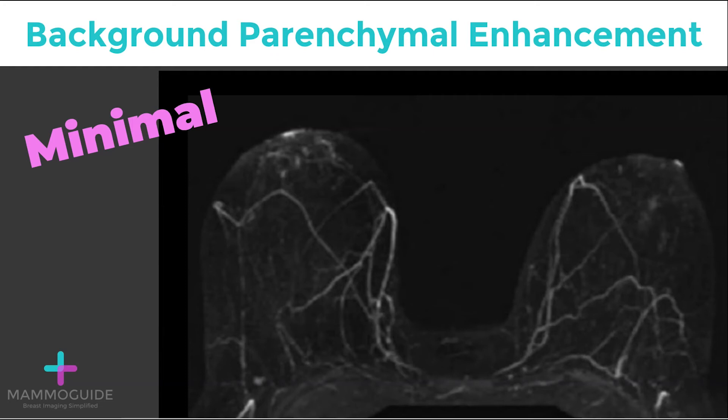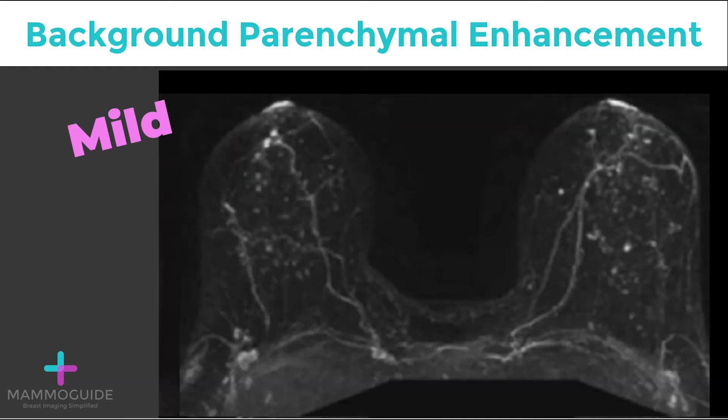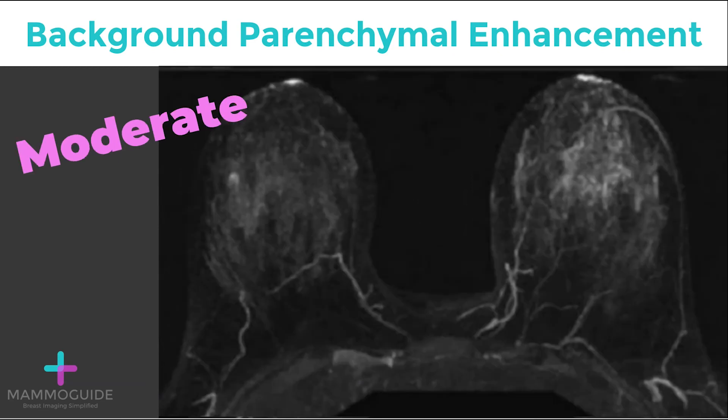The first category is minimal — less than 25% of the breast lights up. The next is mild — 25% to 50% of the breast lights up. This can be diffuse or stippled enhancement throughout the breast, such as in this case.